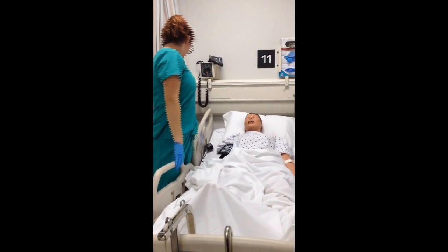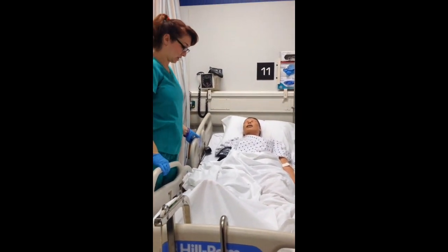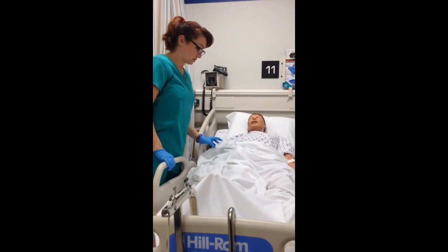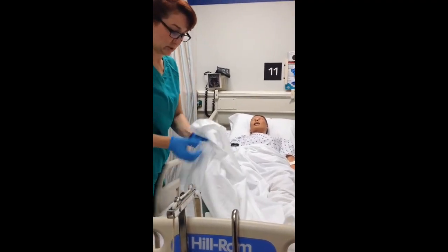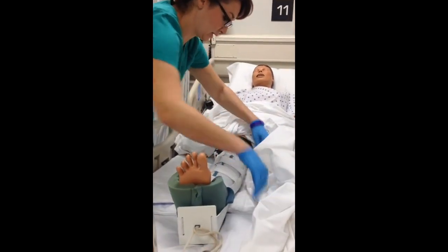Do you know what year it is? 2017. So what I'm going to do is check your traction — your boot for traction — to make sure it's appropriately placed and check your neurovascular status.